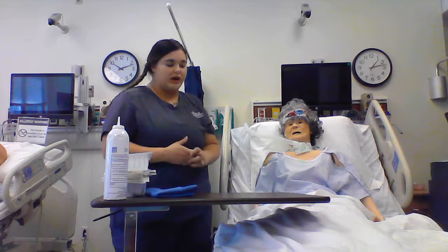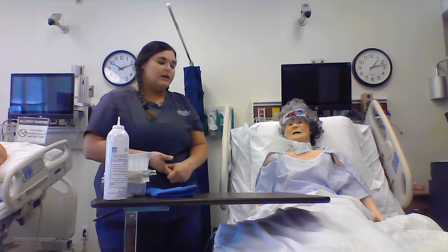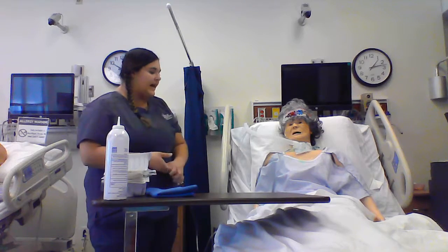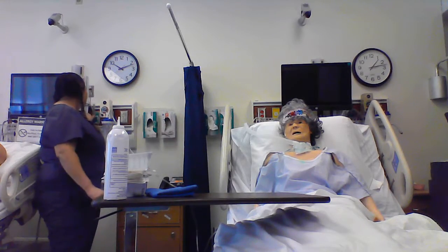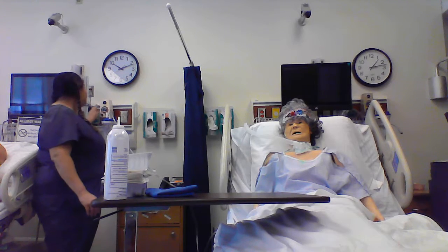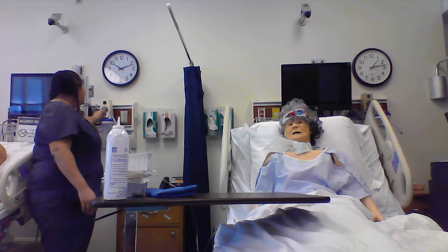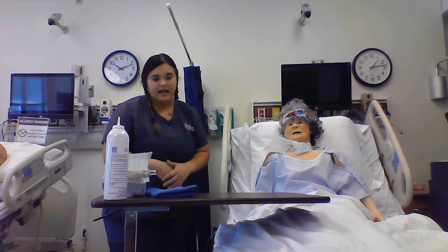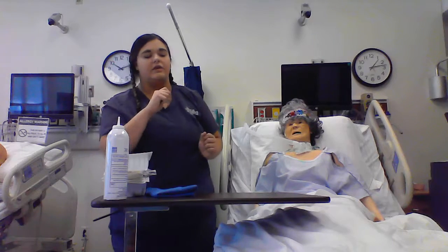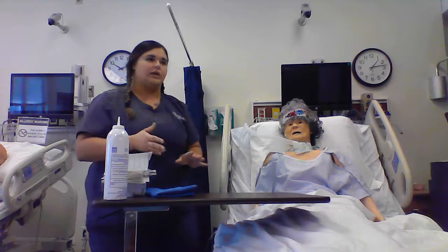So we're going to go ahead and suction her out. Her pulse rate and respiration rate are also kind of high, so we're going to see if suctioning will fix that. So at this point, I'm going to go ahead and hyperoxygenate my patient. I'm going to turn my suction on between 80 and 120. Ms. Opal's secretions are a little thinner than some, so I've got her suction closer to 80. If they were thick or hard to get out of the inner cannula, I would turn it up a little bit higher, towards 120.